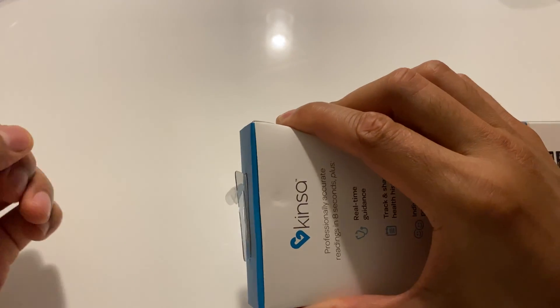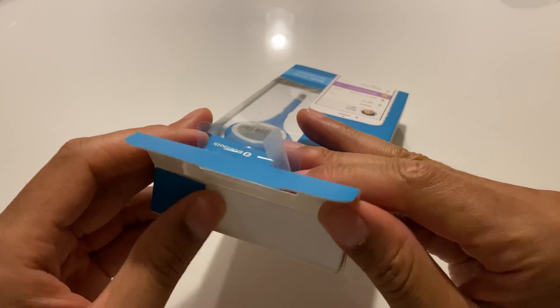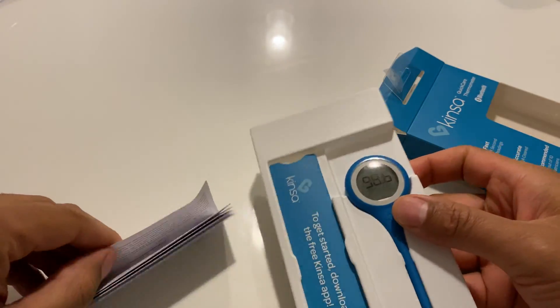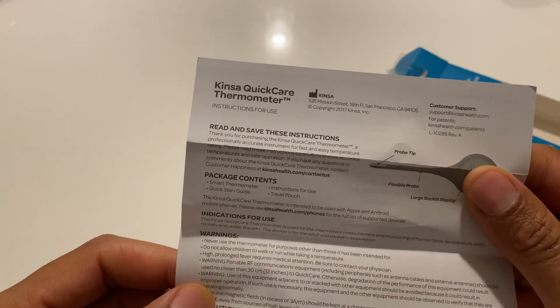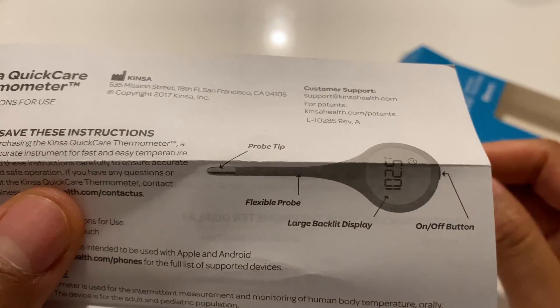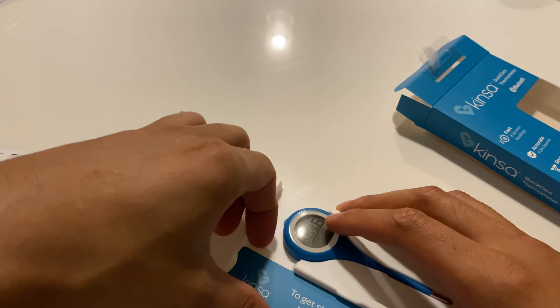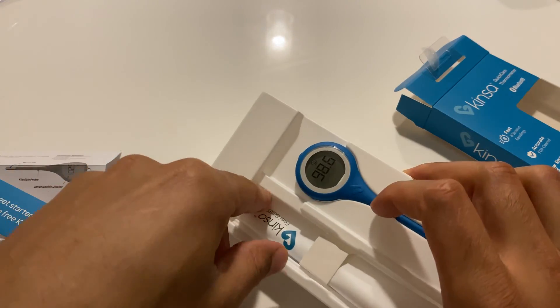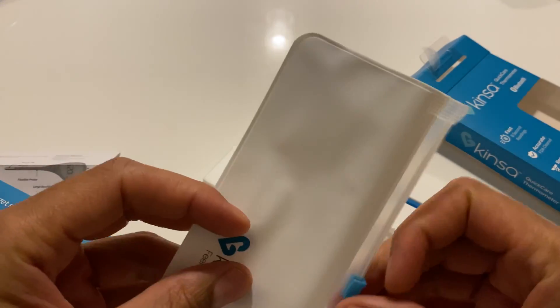I peeled the piece of tape off. I'm just going to pull this back and slide it out. Right here, I think this is some sort of instructions. It says read and save these instructions. It shows the probe tip, flexible probe, and large backlit display on top. There seems to be something else in here, and there's a packet over here too.